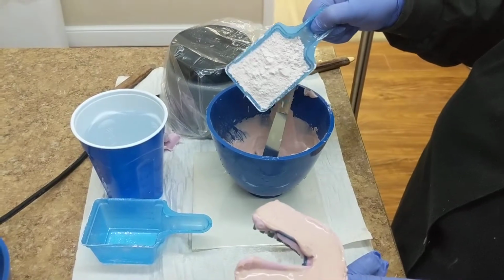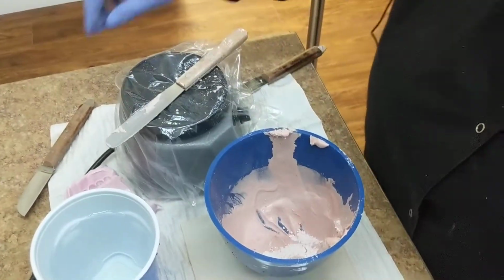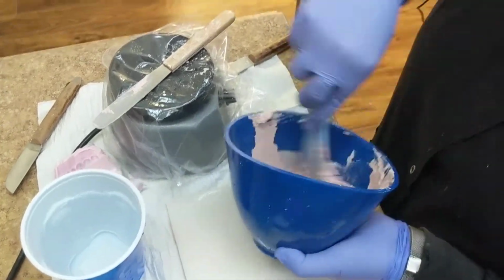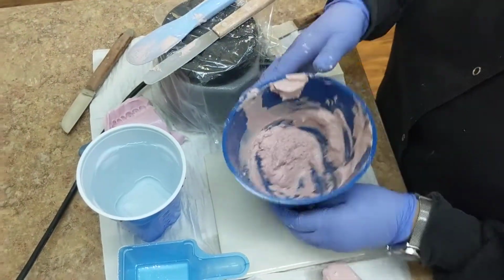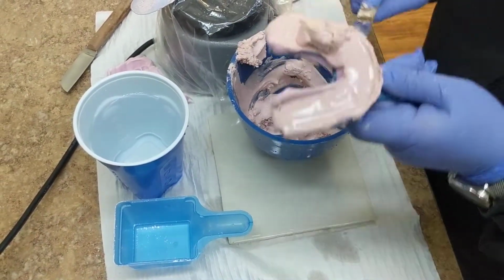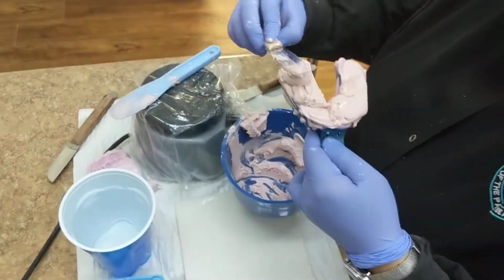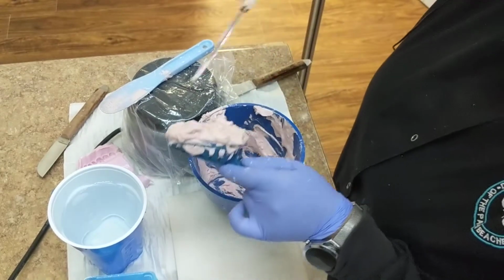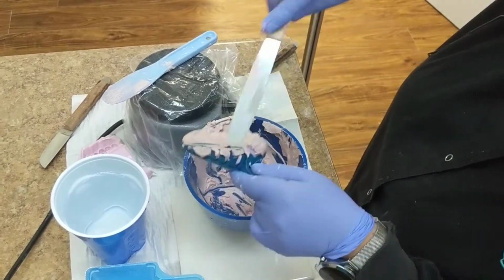I'm going to put a little bit of stone here, because for this you want it to be a little thicker. You want a chunky peanut butter now. Just combine a little powder. And now we're going to create a base. The base needs to be at least 1/4 of an inch thick. So you're going to add the stone to it. Just like when you ice a cupcake. So after you add the stone, with the side of the spatula, you create that thickness.